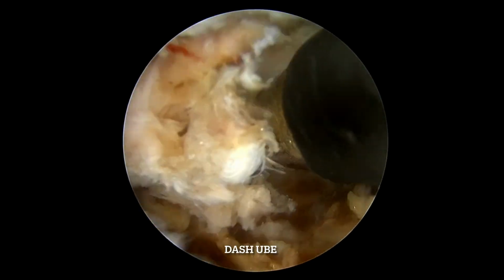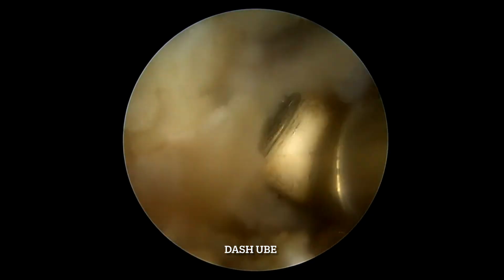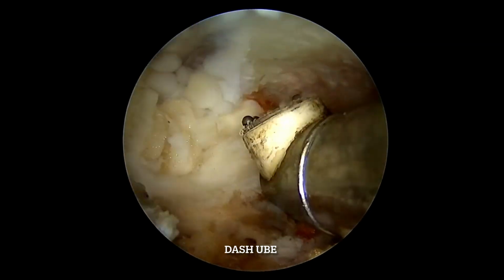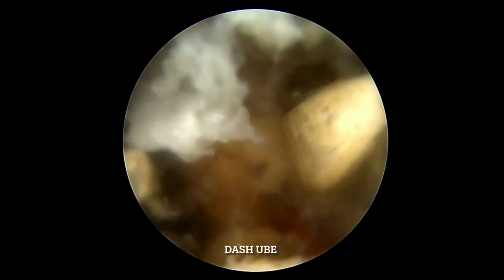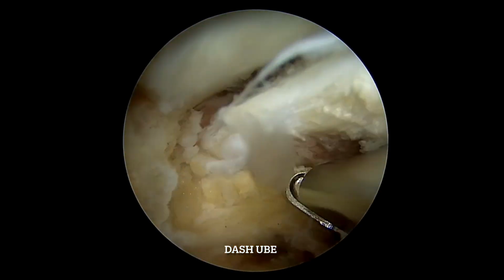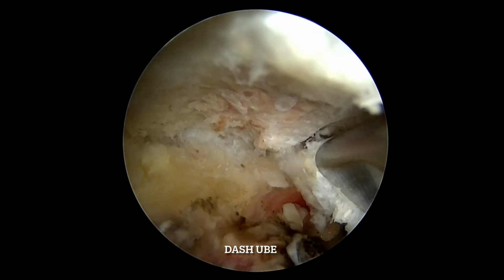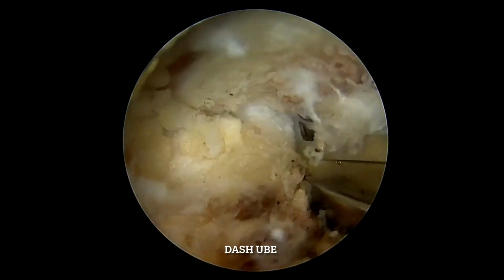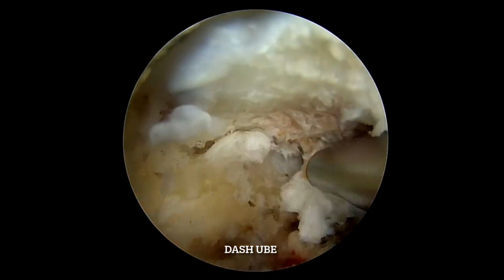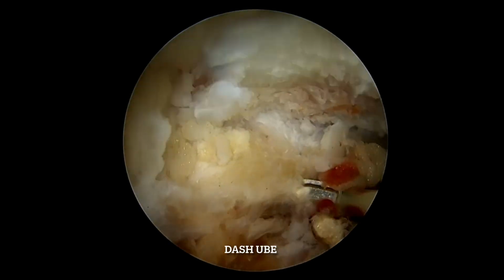In these cases, the tip of the SAP, the joint capsule and the gap between the two joints are very well visualized. This is the foraminal ligament. You are seeing the yellowish part of the ligament which is covering the exiting root. Now I'm working on the tip of the SAP, which points towards the direction of the exiting root. Small Kerrisons are very handy in the initial trimming of the foramen.